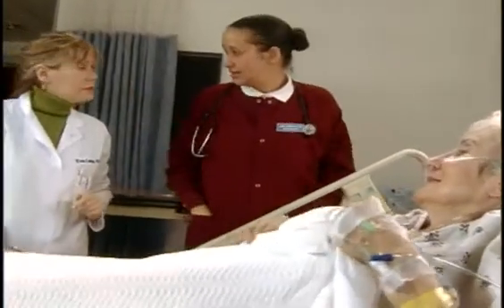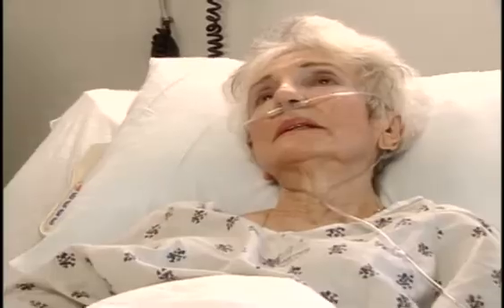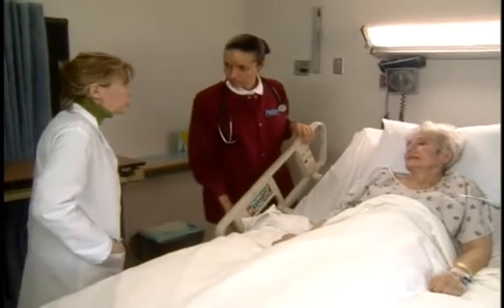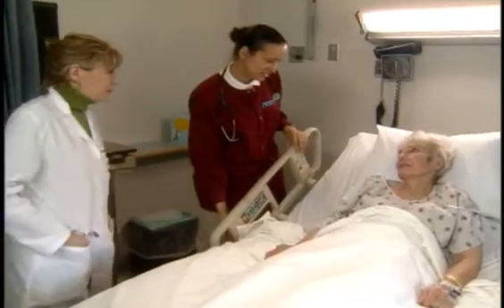Okay. Last thing as always, document the procedure. Note the nature and amount of the secretions, your respiratory assessment before and after the procedure, and your patient's response to the procedure.